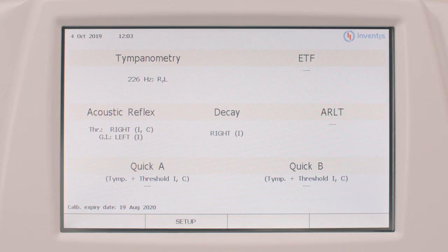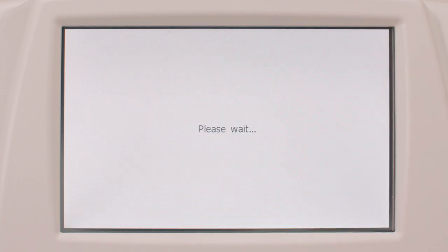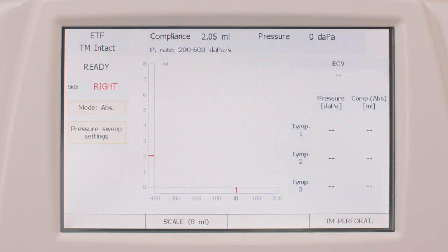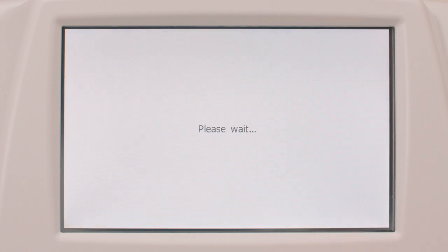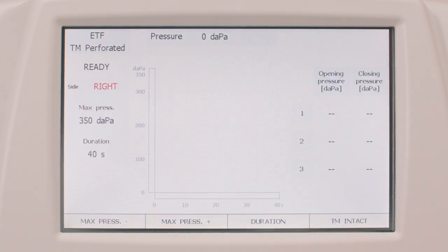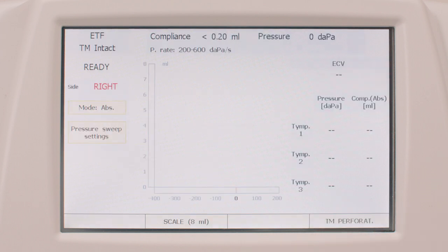Let's jump now to another set of exams. Eustachian tube function tests for patients with intact and perforated eardrums are available on both Clarinet Basic and Plus. Access the ETF for intact eardrums by simply pressing the corresponding button on the Clarinet keyboard. Function button 4 is then used to switch between ETF for intact eardrums and perforated eardrums.